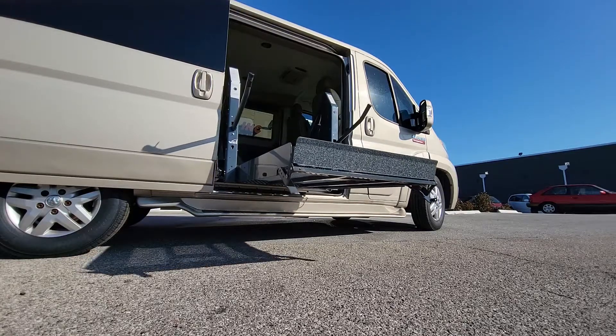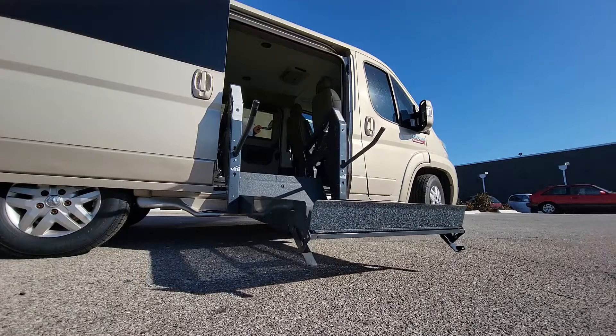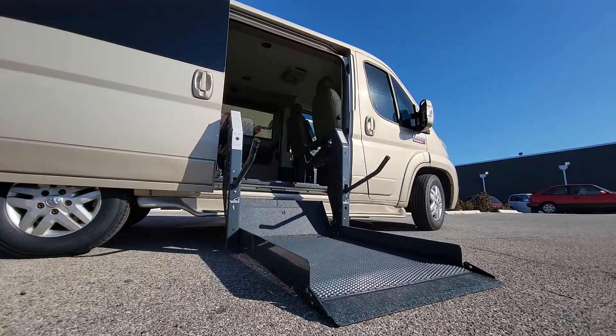the rear barn doors, and it's even able to have a UVL or under vehicle lift installed on the outside undercarriage of the vehicle.